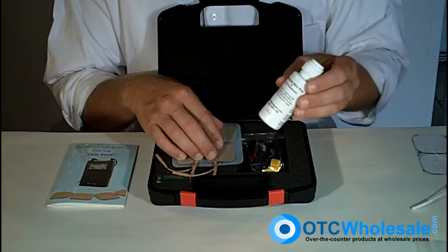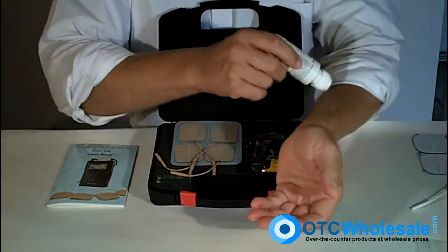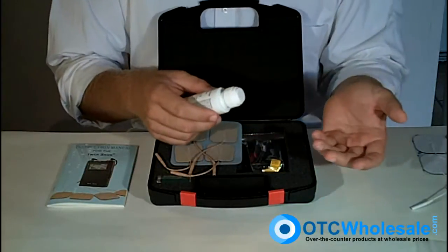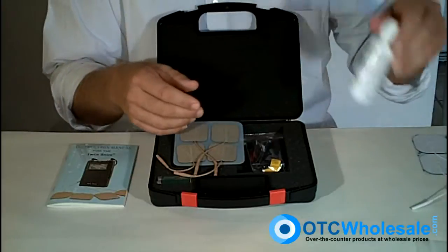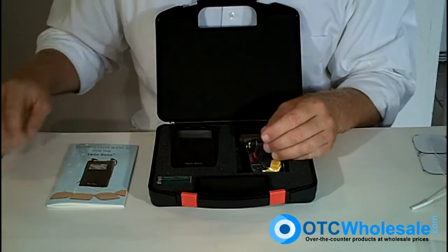Also get a skin prep with some antiperspirant in it — this makes a huge difference. Put this on the treatment area; it keeps the treatment area dry, increases the life of the electrodes, and increases the connectivity so that you get more of the stimulation actually being delivered to the site. Skin prep with antiperspirant is absolutely invaluable.